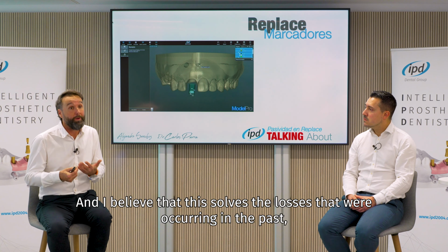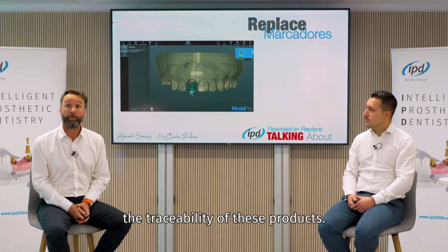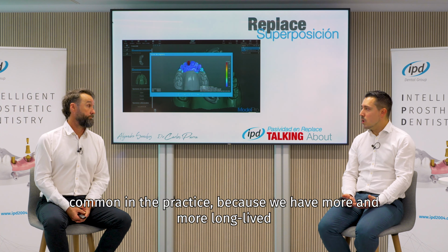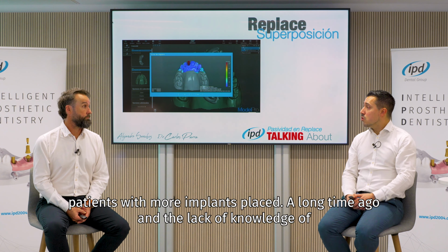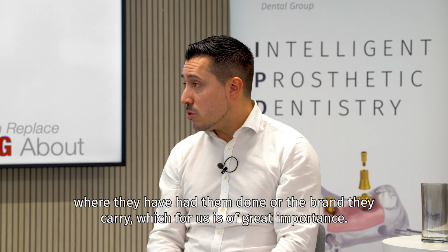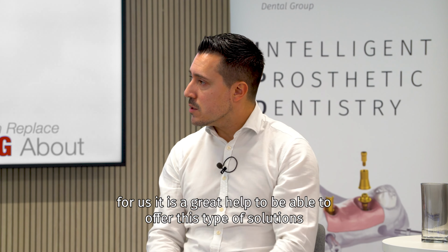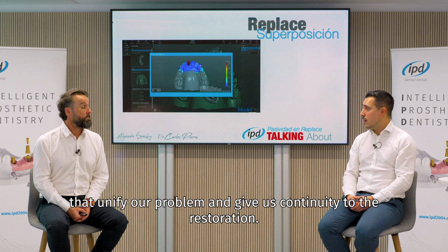And I believe that this solves the losses that were occurring in the past, the traceability of these products. And also, unfortunately, this is a situation that is becoming more and more common in practice because we have more and more long-lived patients with more implants placed a long time ago, and a lack of knowledge of where they had them done or the brand they carry, which for us is of great importance. For us, it is a great help to be able to offer this type of solution that unifies our problem and gives us continuity to the restoration.